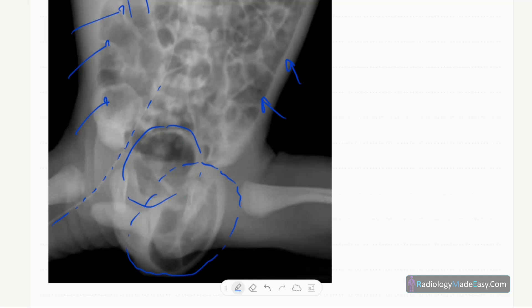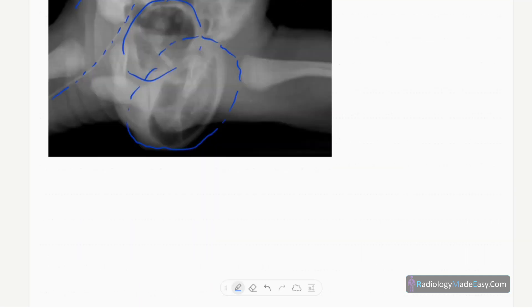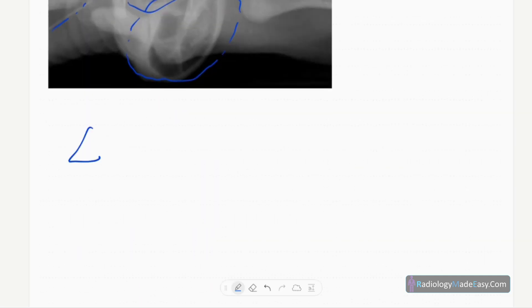You don't see any pneumoperitoneum, intramural air, or pneumatosis intestinalis. You can see the liver shadow here, so you cannot comment on portal venous gas. There are no obvious bony abnormalities — the visualized bones are normal. The diagnosis in this case is bowel obstruction.